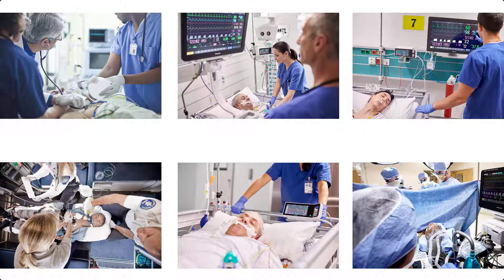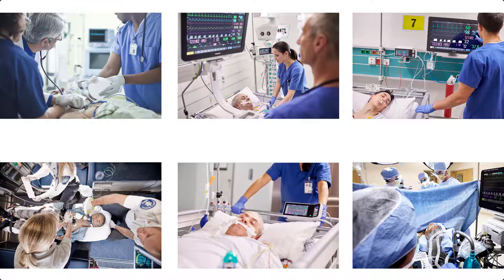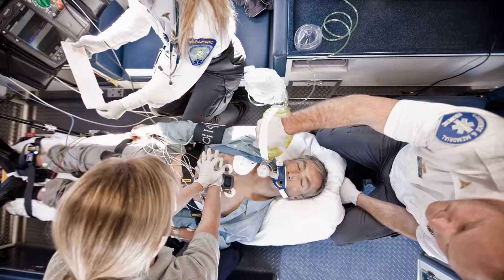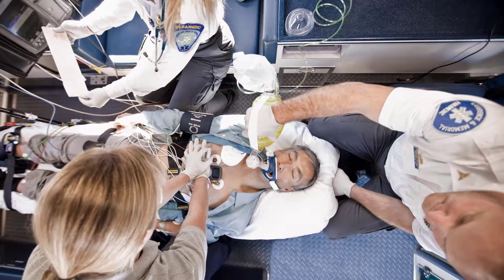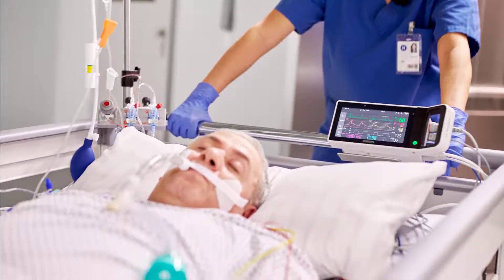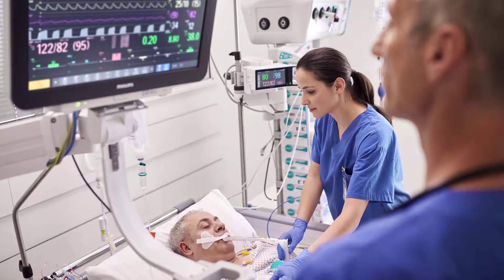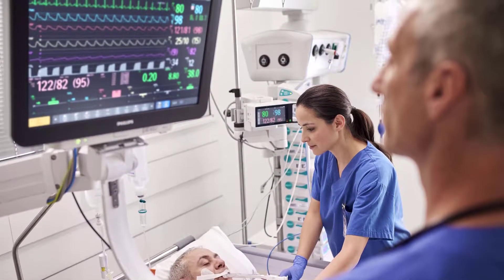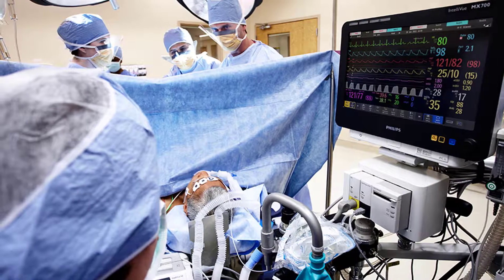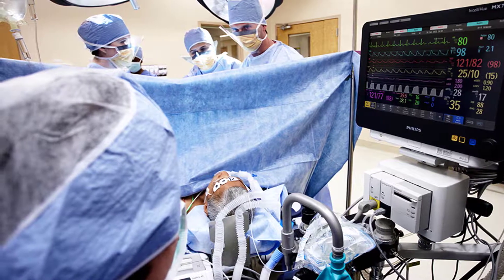Capnography has its place in many clinical areas. Use capnography to confirm tracheal tube placement. Monitor the effectiveness of chest compressions during CPR. Monitor CO2 waveforms during transport to assure the integrity of airway and ventilation. Monitor the efficiency of mechanical ventilatory support. Monitor CO2 in anesthesia to immediately detect unexpected changes in respiration when a patient is sedated during a procedure.